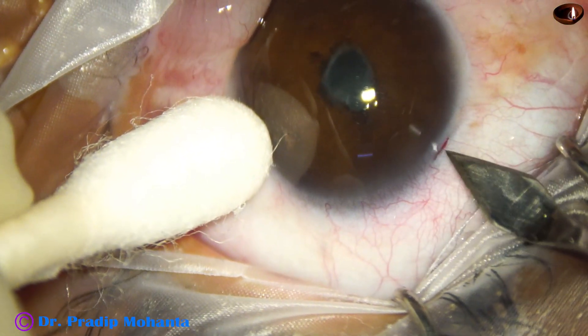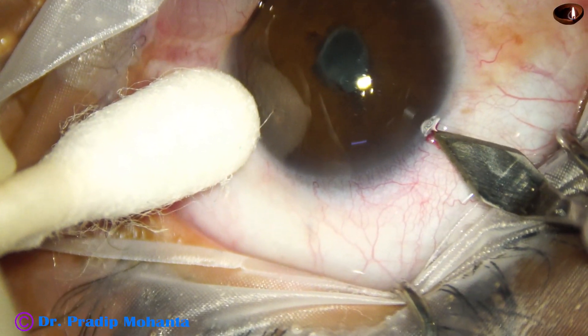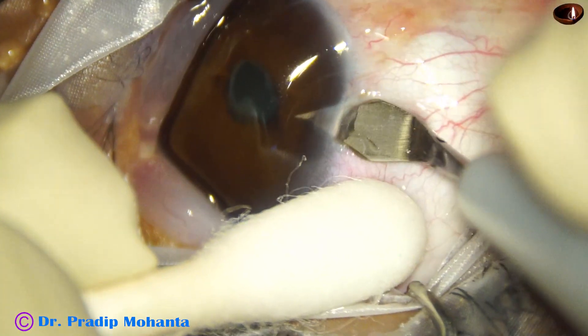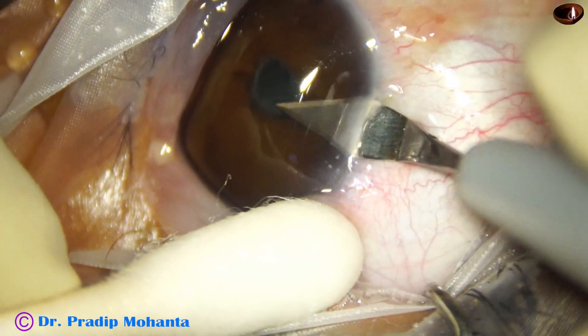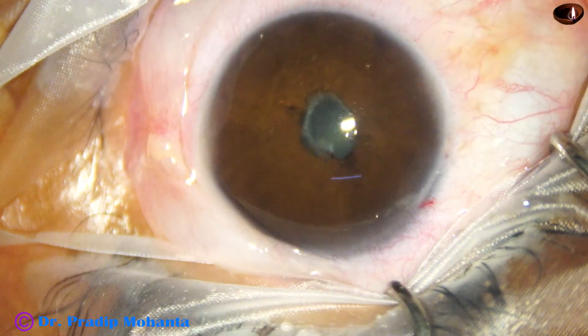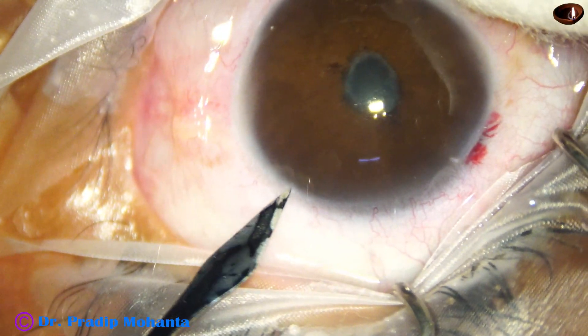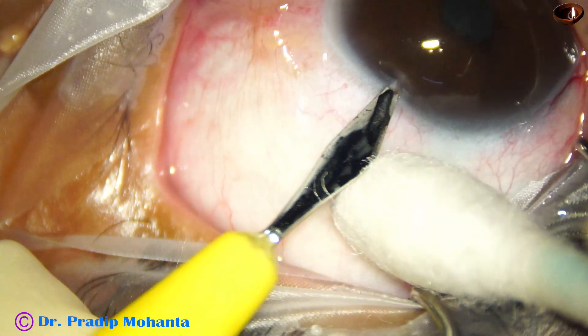This is the main incision with a 2.8 millimeter steel keratome. There is some oozing of blood because the incision has included some capillaries. Healing is much better and much stronger if you include some capillaries in the incisions.